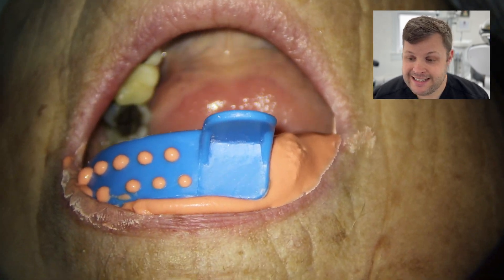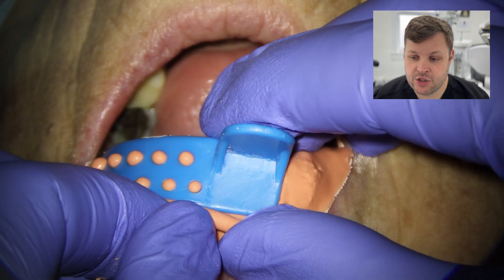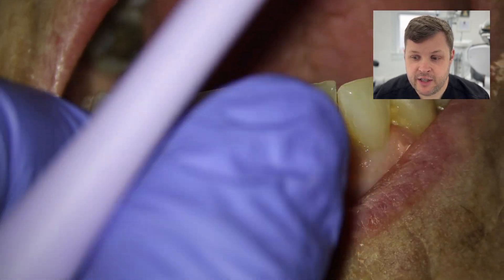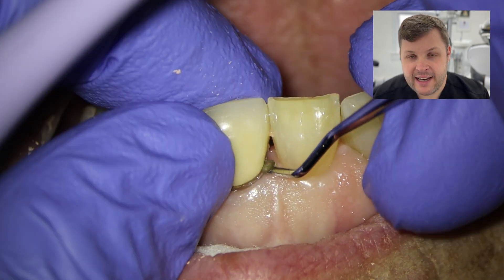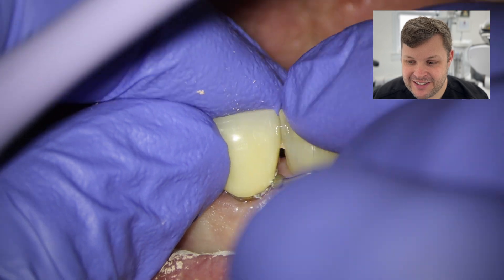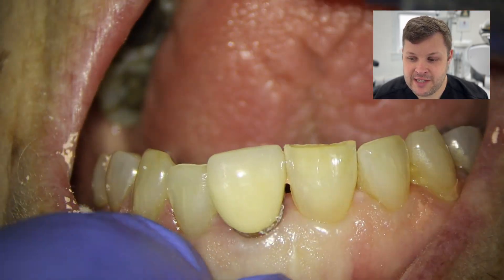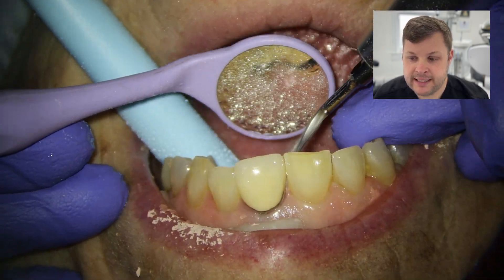I'm going to take a sectional alginate index — just a negative copy of the crown we're going to be taking off. I was pretty sure this crown was very loose, so in the first instance I tried to use an excavator to undermine the crown and push it off.